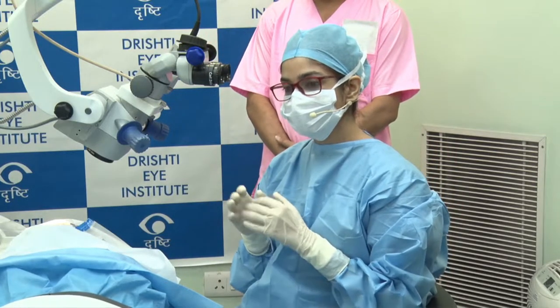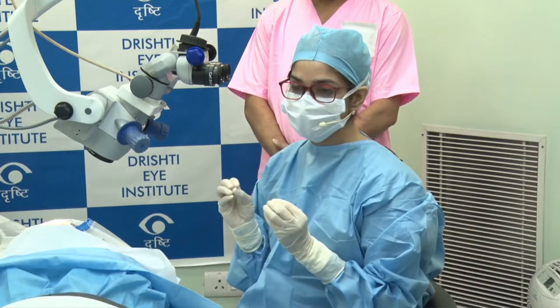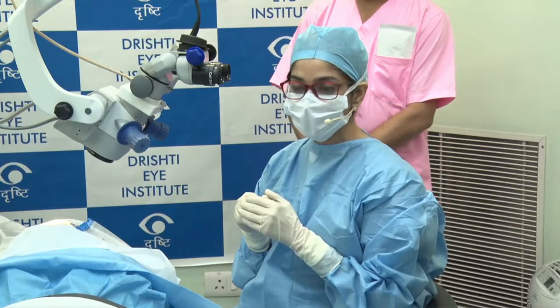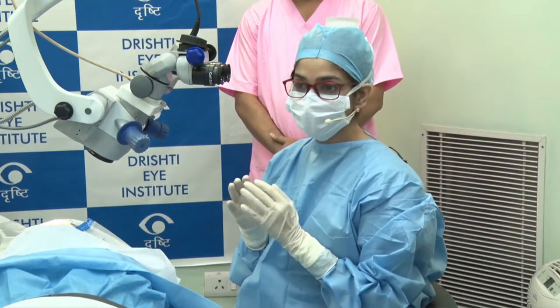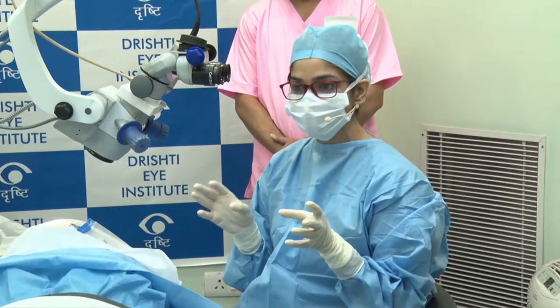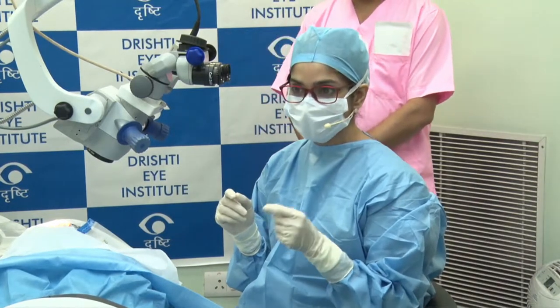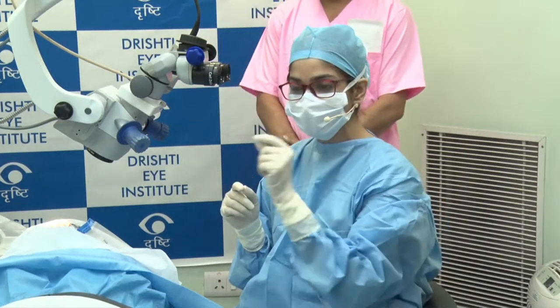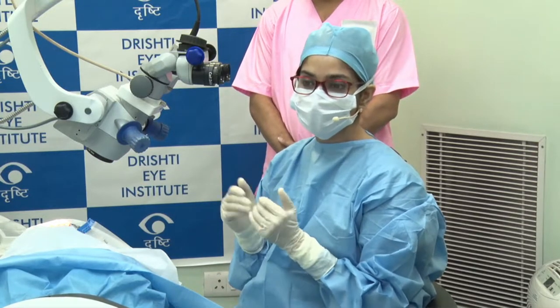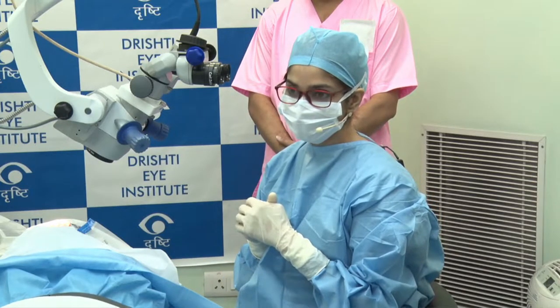In your mental space, you have to decide the site of injection preoperatively itself when you're doing gonioscopy on the slit lamp. So if you see a very fine open angle nasally, you know that these are the two quadrants that I'm going to. It's also a good idea to mark. Like how we mark for toric IOLs, you can place marking spots where you're going to inject preoperatively, which makes your life easier intraoperatively. Okay, thank you so much.